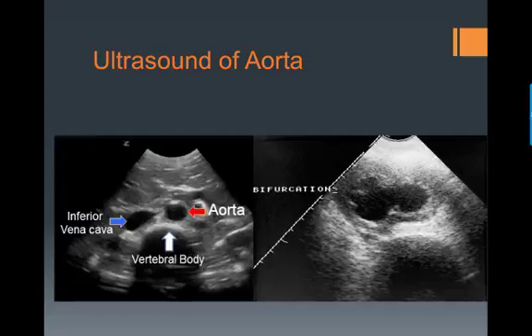The key to identifying the aorta is to first locate the vertebral body, which can be seen at the bottom of both of these ultrasound images, and it appears as an upside-down horseshoe. The aorta is going to be just above the vertebral body on the right of the screen.